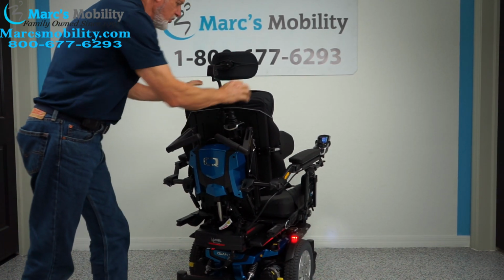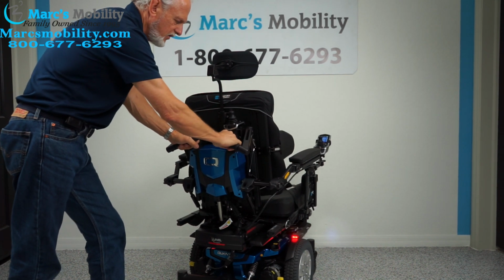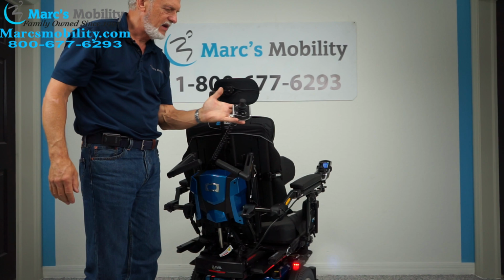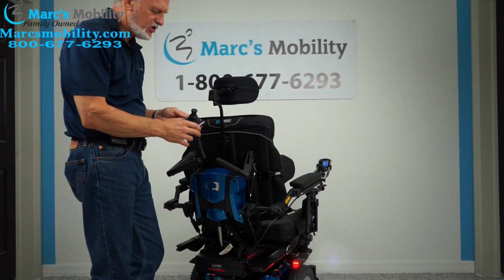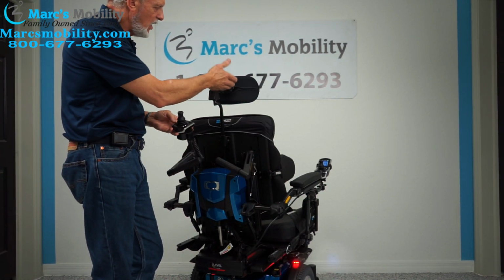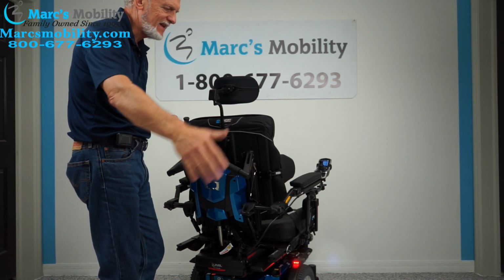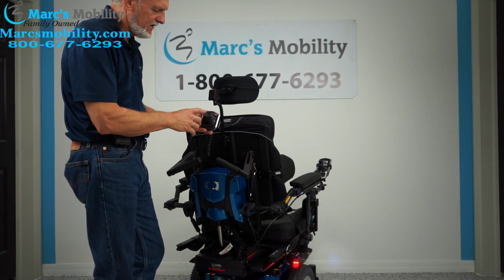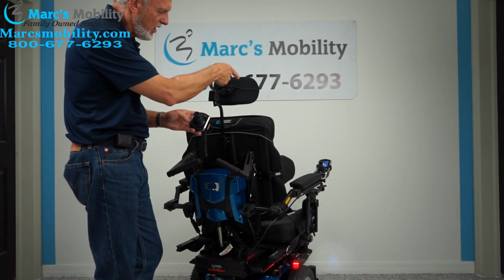If you had to push it, instead of pushing on the seat, you've got push bars that are tied right to the frame. You also have back here an attendant control. I can drive this chair from here. So if you have a patient or a person who cannot drive, you need to move them around the house instead of having to push them, switch, hit the first button here, and it shuts that one off in front.